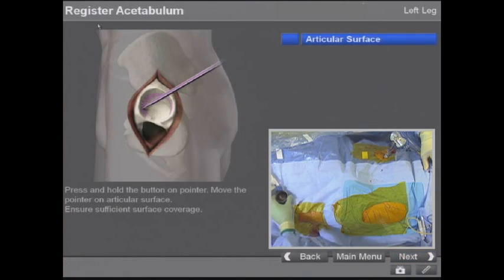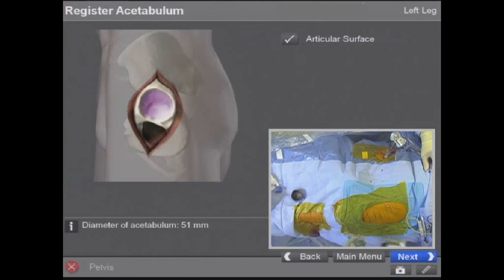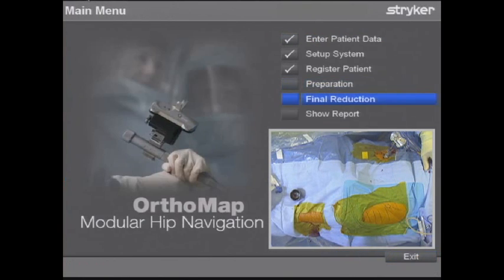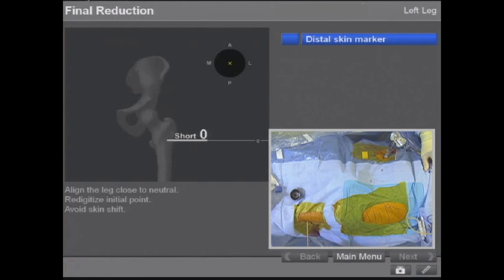To make sure we can find that hole again, we go through the process as if we're done with the hip — we register a fake socket and do a post-reduction. Of course this should give us a reading of zero since we haven't done an operation yet, and sure enough it gives us zero. So we know we can find the hole, it's accurate, and the X is in the middle of the ML and AP dimension.